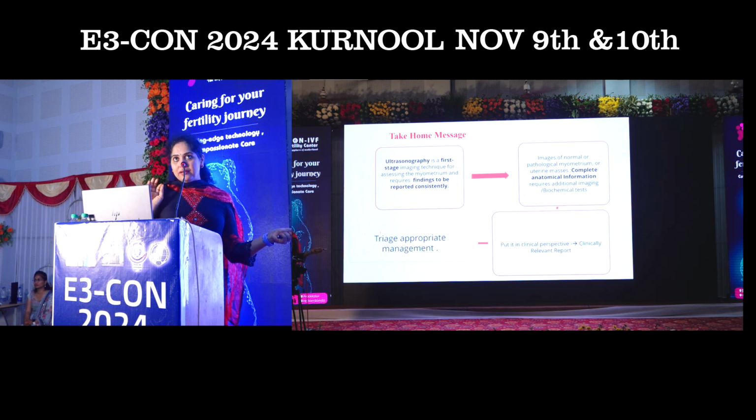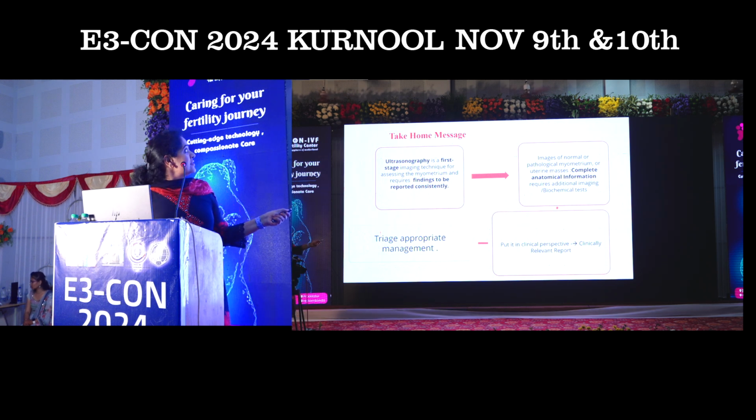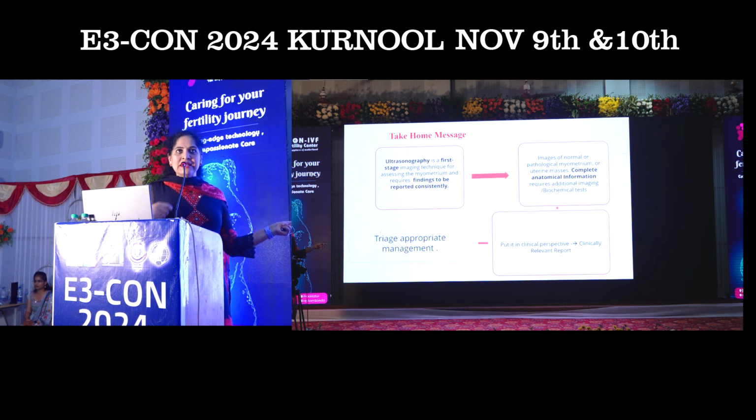Identify, detect, distinguish, and then diagnose. So take home message is ultrasonography is the first imaging technique for assessing myometrium and requires findings to be reported consistently. For that you need to really practice the terms, definitions and terminology. Images of normal or pathological myometrium or uterine masses.